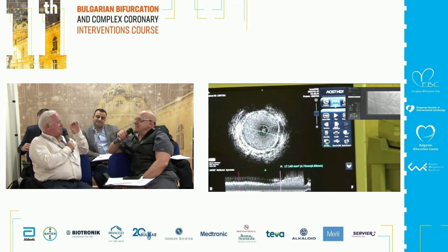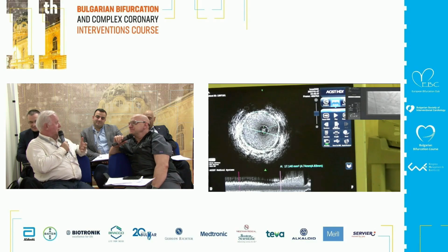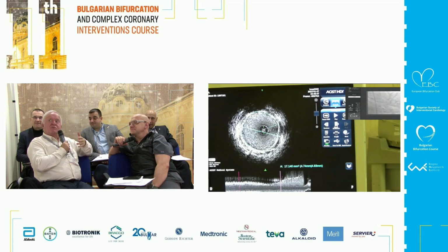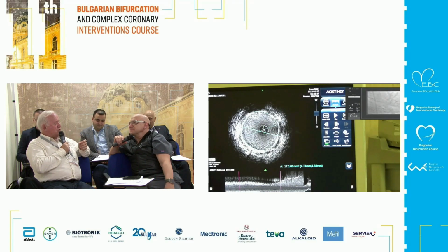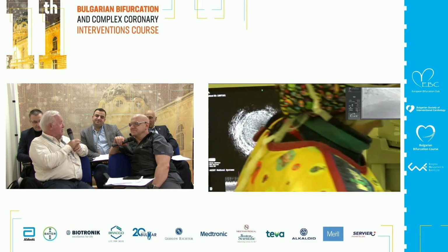I want to remind you that the main reason we are not doing, of course, it's very nice to see the result of a good job, I would like to do that in all patients. So the real problem, if we do IVUS to all the patients we treat for left main, we have to take the money from our pocket.